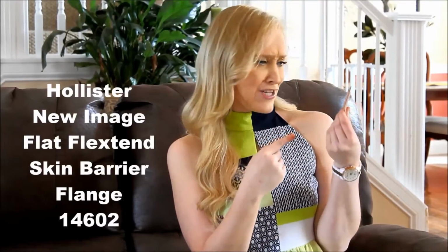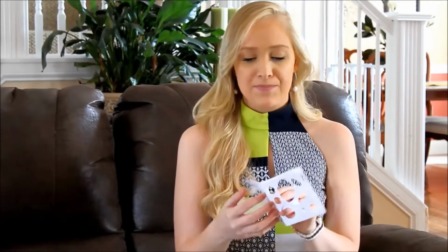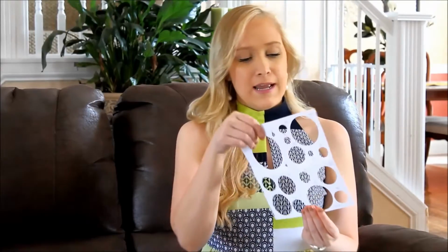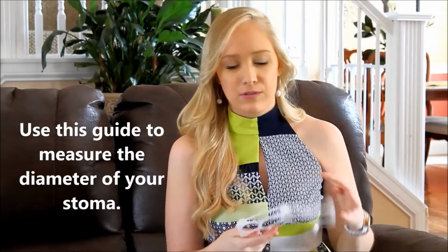So then once the spray is dried, I just take my flange. I pre-cut my flange. Flangey flange. That's a cool word, isn't it? Flange. So I pre-cut mine. Hollister products send this little measuring guide in the box with your flanges. And right now I'm just at about 29 millimeters, maybe a little less.